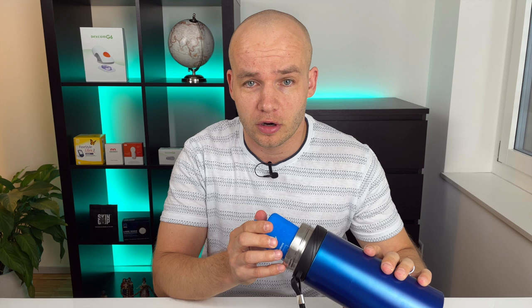My pro tip is: before you head for a trip, put the entire thermos bottle along with the ice pack in a freezer without the lid and let it sit there for 6, 8, or 10 hours. And when the ice pack is frozen solid and the bottle is really cold, then you can take it out, put your medication inside, and put the lid on it.